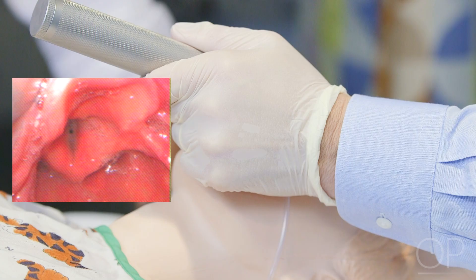It is often helpful for the intubator to announce recognized anatomic landmarks such as the epiglottis, posterior cartilages, and vocal cords as they are visualized.